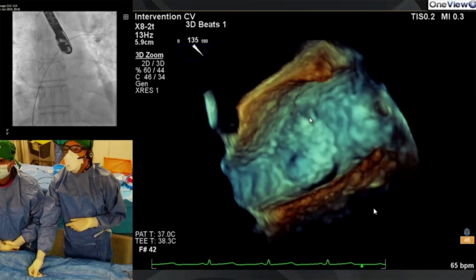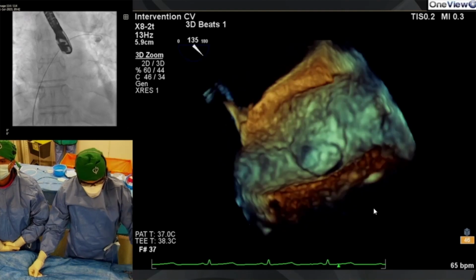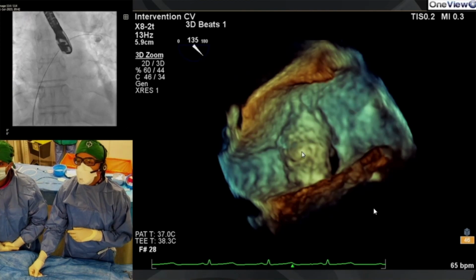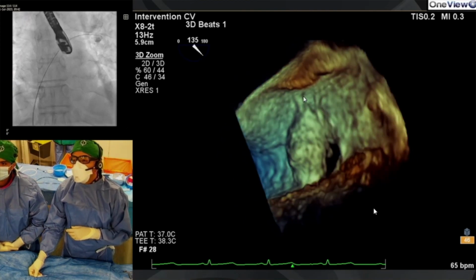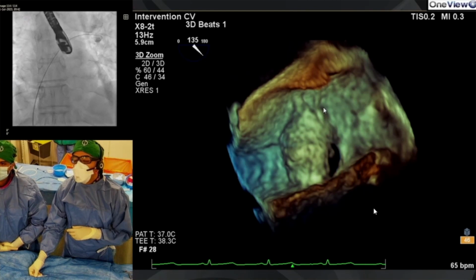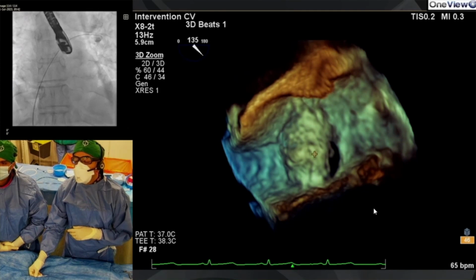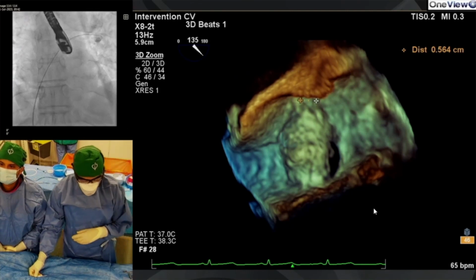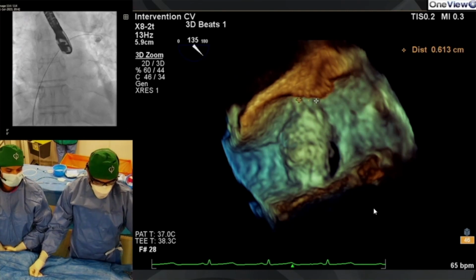And I'm just going to see if I can stop it at the right place. Kind of there. So can you see if I'm going to move this image around? It looks like the opening is here. But what's also interesting, and I'm not sure, is whether there's something else going on here and whether this is a lip of tissue that is sealing in between, so that you almost have two orifices. I don't think there is, but I'm not 100% sure looking at this imaging. What's important to note is if you look at the opening of the PFO, it's quite small. I measured about 6, 7 millimeters.